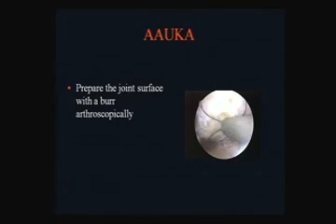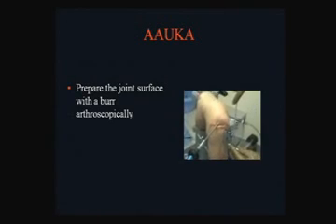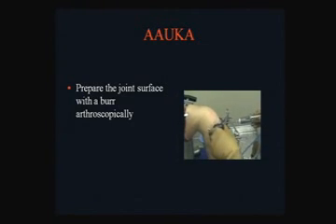So what's in the future? Well, I've been working for 3 years to try to get an arthroscopically assisted unicompartmental replacement approved in the U.S. There are 2 other companies that are trying to do this. We've been very unsuccessful with the FDA. Everybody has, because the FDA is being so stringent.